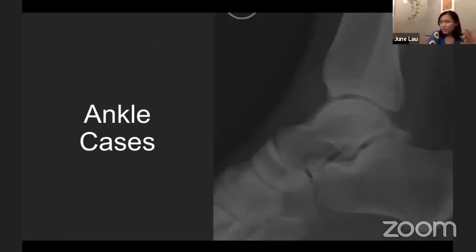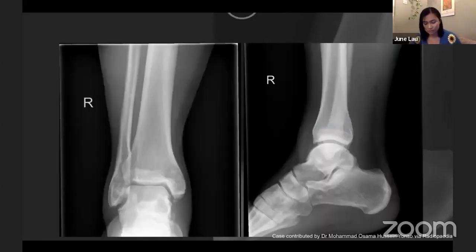And that's it. So it's much easier, the ankle. And now that we're happy with the ABC2S method, what we're going to do is run through our last batch of cases. So I am going to start a timer, and then show you the first case.